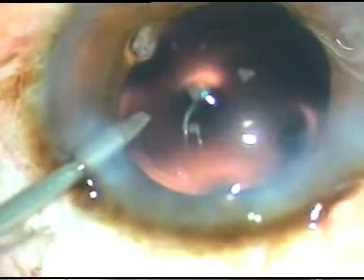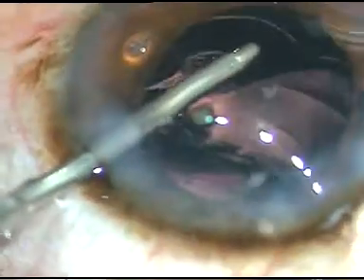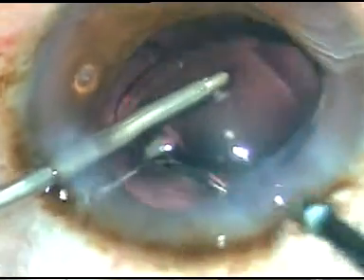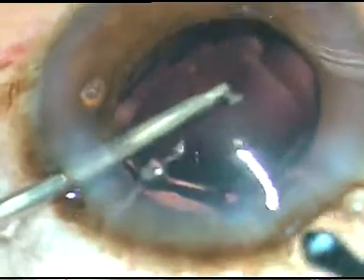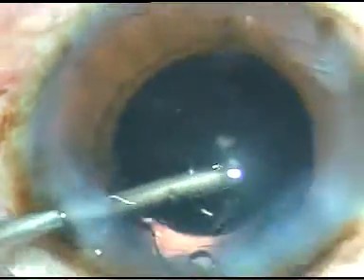An intraocular lens is implanted in the capsular bag under irrigation. The irrigation keeps the anterior chamber formed, and with the tap of the left-hand instrument, the trailing haptic of the IOL goes into the capsular bag. That's it — we have finished this case.